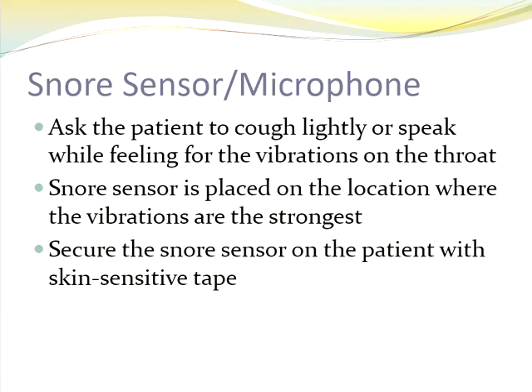The snore sensor, essentially, remember, we don't have to prep the skin to apply this because it's just picking up vibration. It's not picking up the electrical conductivity of a muscle or of the brain waves or anything of an area of the brain. It's just picking up vibration. So all you're going to do is figure out what size tape you want and kind of create a sticker with the snore sensor, feel the patient's neck and have them either cough or say something while you're feeling for the vibrations, and place it where you feel the vibrations are the strongest.